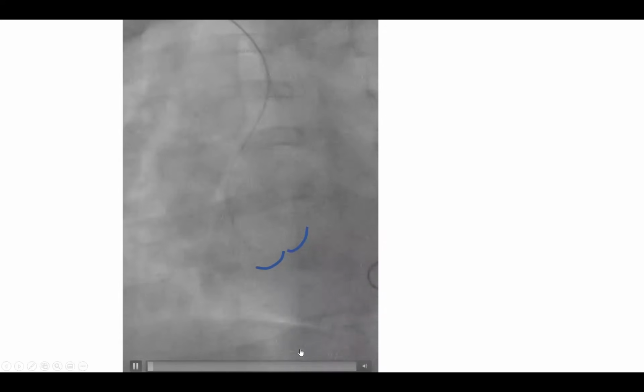Once I jumped, I pushed it. Again, watch the jump. You see it? It's a subtle but abrupt motion. You see it here. So once it jumped, I pushed it and looped it from below. Okay.